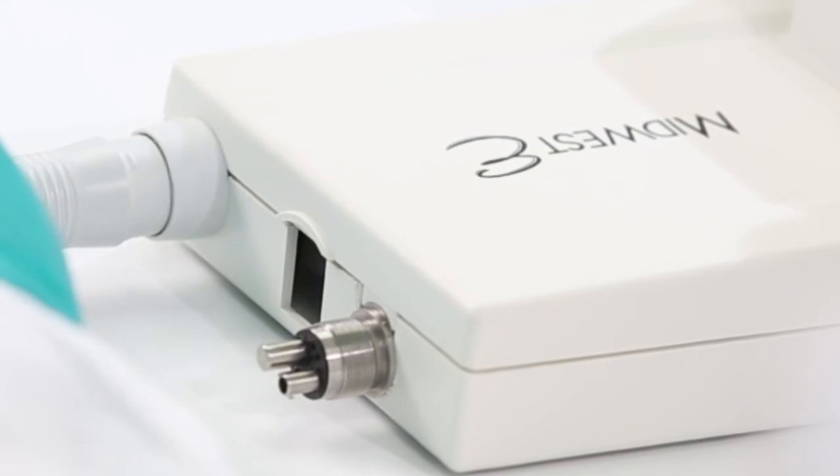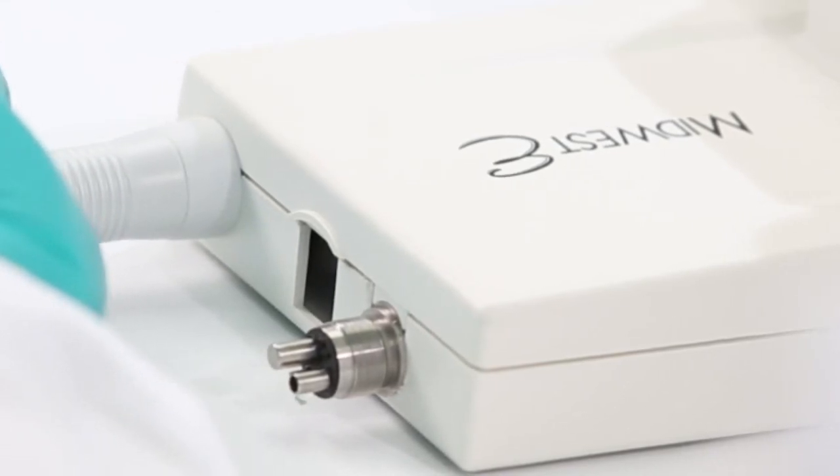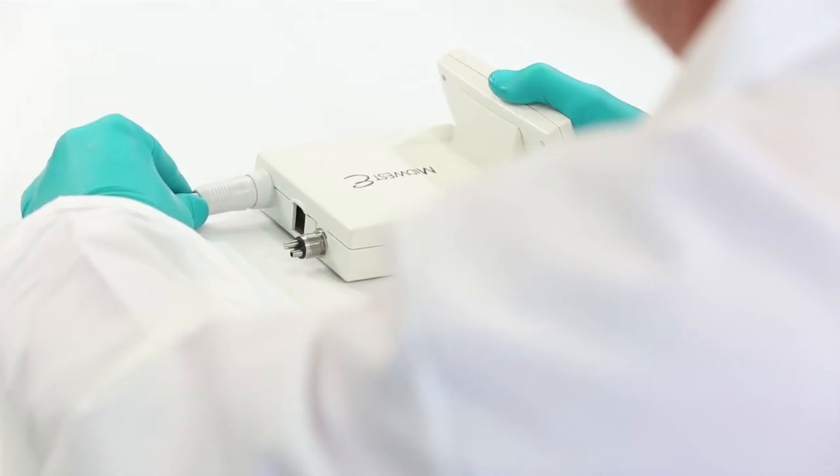Ensure that the hose is inserted completely. Removing the hose is accomplished by pulling straight outward.